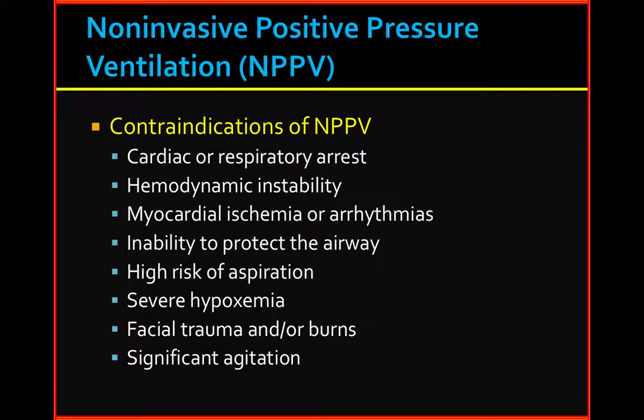The other thing we can do is decide how much pressure to leave in there at the end of when we put the air in, and then how much pressure to leave in there after we're done putting the air in. Finally, we can decide how much oxygen we want to put in there. We can put a lot or we can put a little.